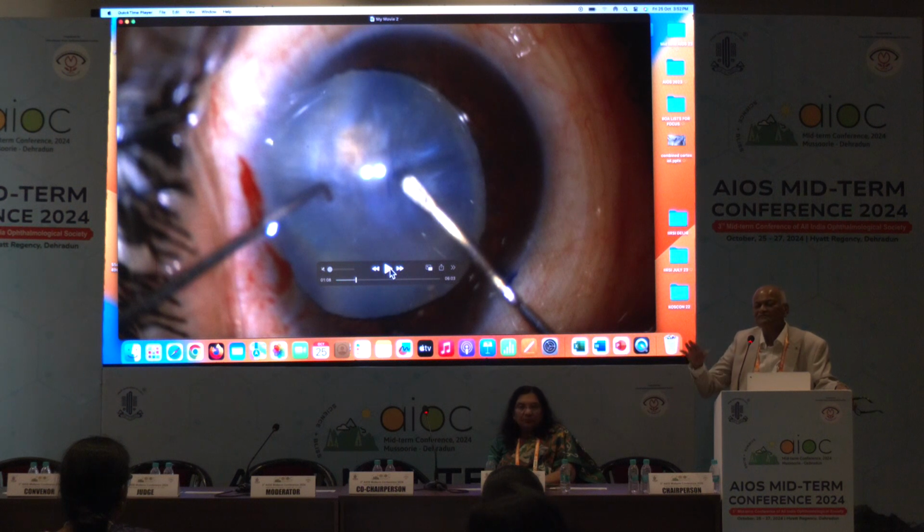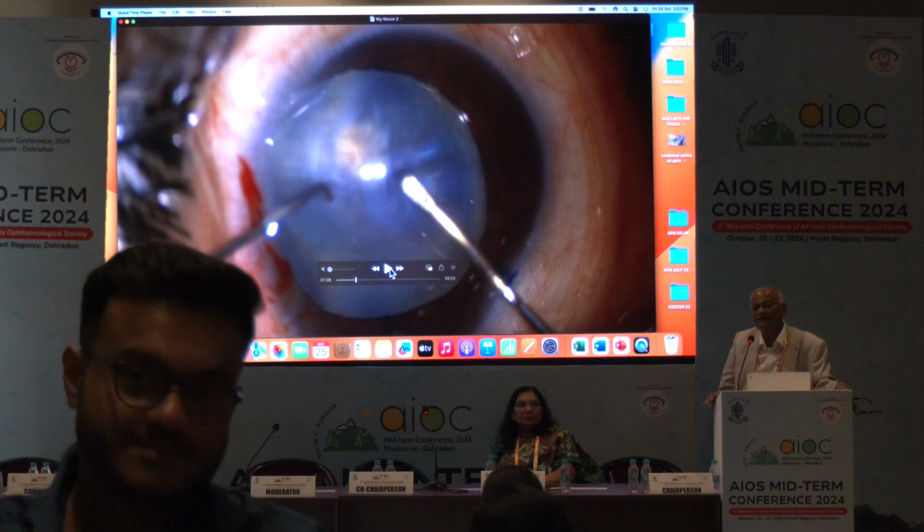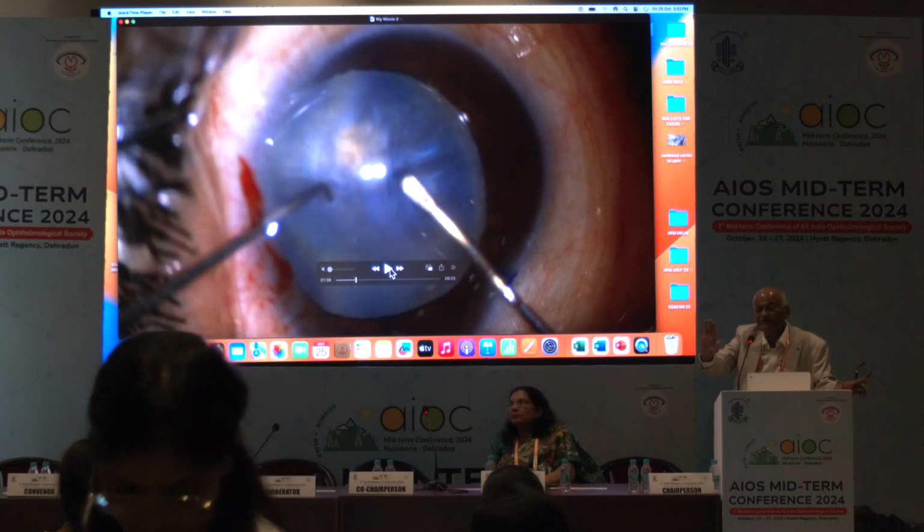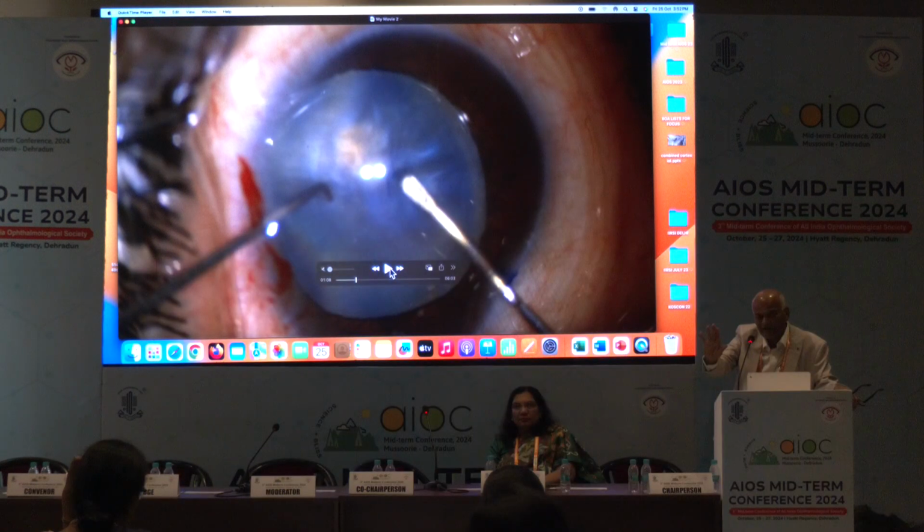Why? Because at other places, glow is seen through the cataract, and here you have cut the cataract, and because of that, glow is more there, and that is the depth where you should stop. You should stop. But if you are going again down, then there will be a chance of the, you can say. So now this is another case.